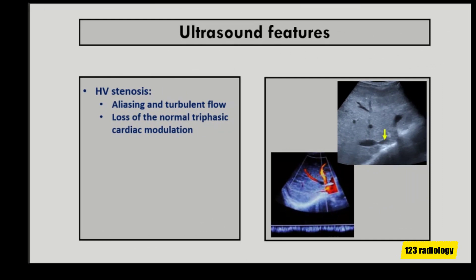Hepatic vein stenosis is less common than thrombosis. Like thrombosis, stenosis can involve one or several hepatic veins. It may be focal or diffuse, partial or complete, and most commonly affects the osteal segments of hepatic veins.